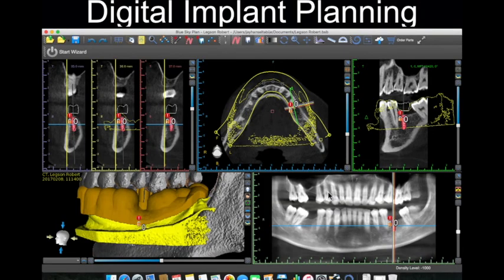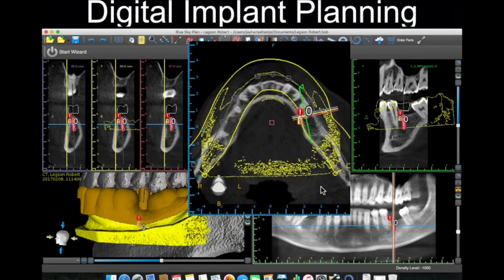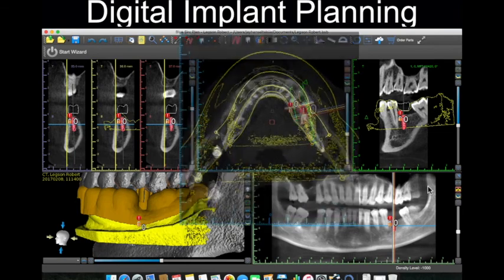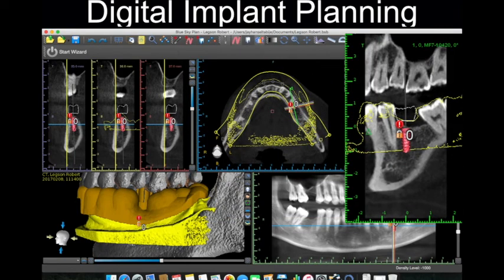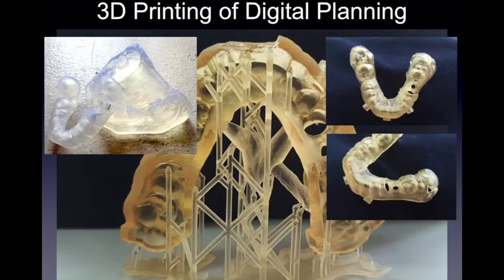Okay? And now it has blown to larger extents in terms of implant planning. Because of three-dimensional imaging, CBCTs, we could now use softwares to actually plan implants ahead of time. And even with the advent of three-dimensional printing, rapid prototyping, we could now create a digitally guided stent that will transfer our plan from our computers to our patient.